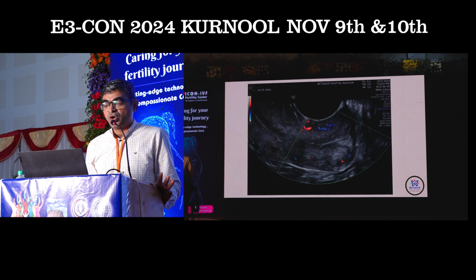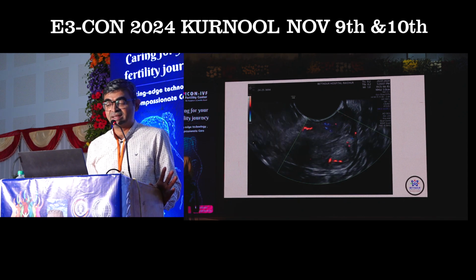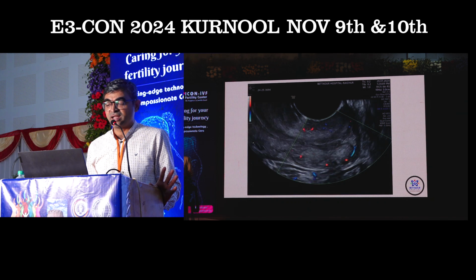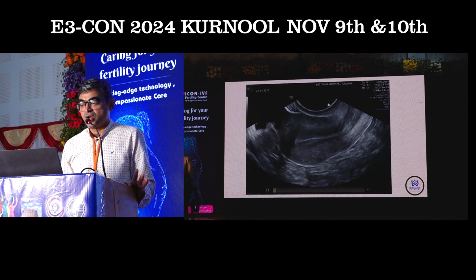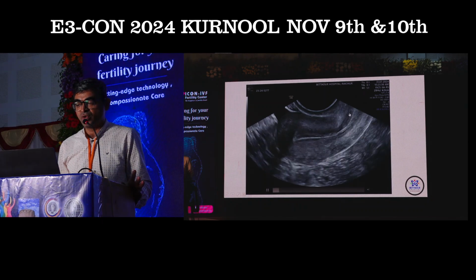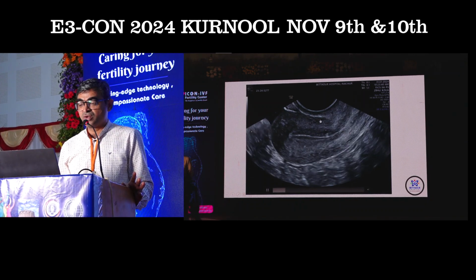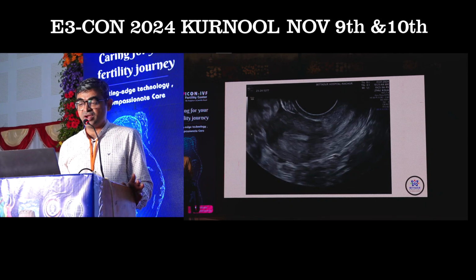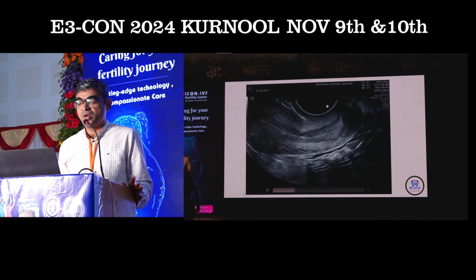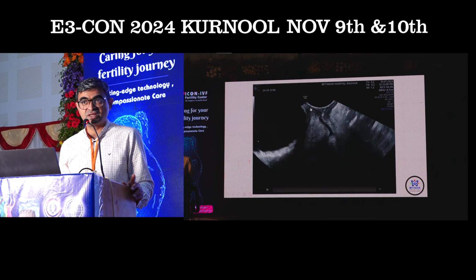This is what we all do. We keep the sector width less. Sometimes we don't look at the cervix, the neglected part. We only look at the corpus, and we definitely lose the information that is there in the cervix. Of late, when I increase the sector width, or bring the cervix to the region of interest here, I am able to analyze what is there in the upper lip, the lower lip, and the endocervical canal.